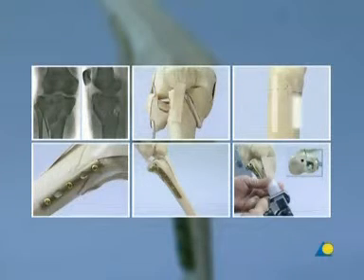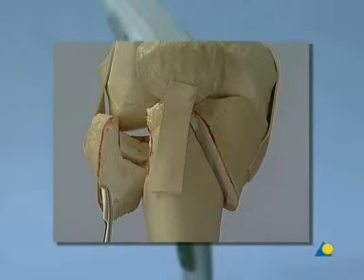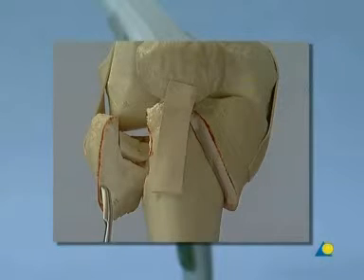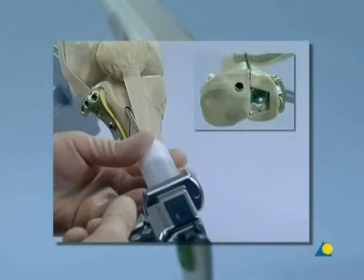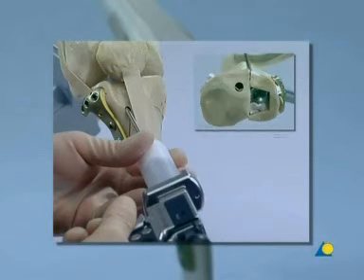This presentation has shown how to achieve stable fixation of a complex type C fracture of the proximal tibia. The critical points for success include: accurate imaging and meticulous preoperative planning to ensure the fracture anatomy is clearly understood; the use of two separate incisions to minimize soft tissue trauma; fixation of the single large medial block of bone first, which helps anatomical reduction of the lateral compartment; the use of the LCP plate placed laterally in buttress mode; and the use of a bone substitute, Kronos inject, filling the subchondral defect created after anatomical reduction of the surface of the lateral tibial plateau.